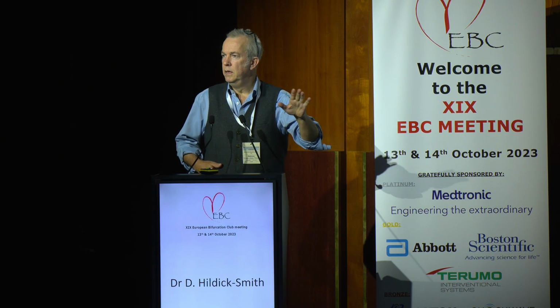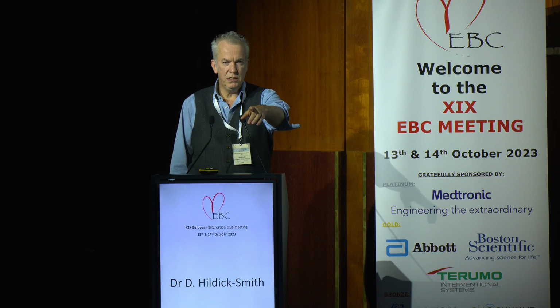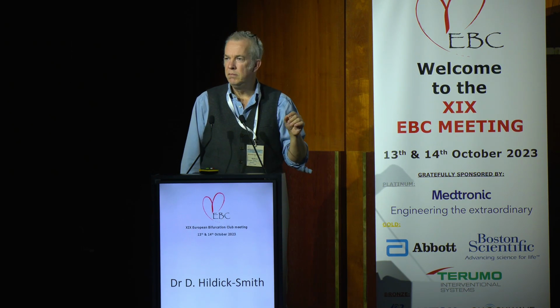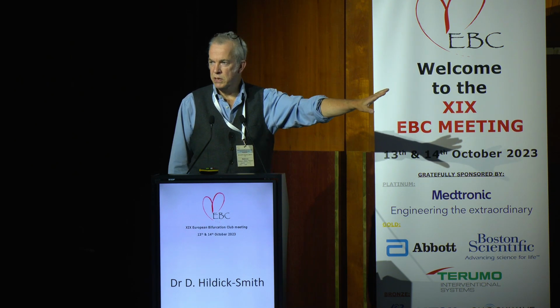There will be two groups. One is the standard provisional stepwise T strategy, which we all know and love. And the other one is a pure drug-coated balloon therapy. Now, the approach for this trial would be just as you suggested: pre-dilatation first, preparation however you like, rotablation, shockwave, simple balloon, cutting balloon, to the main vessel, followed by, if the result is good or adequately good, randomization. After that, provisional T, you know the drill.